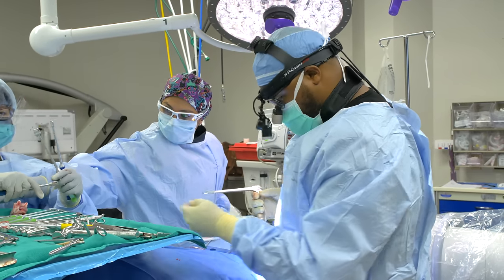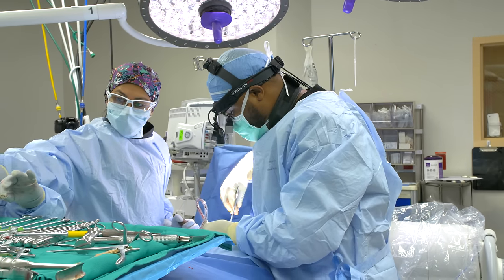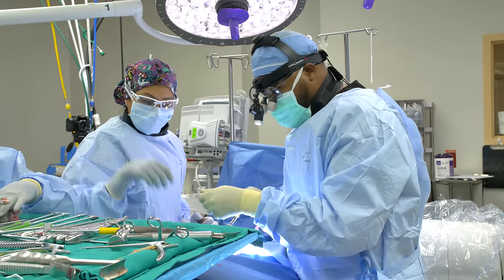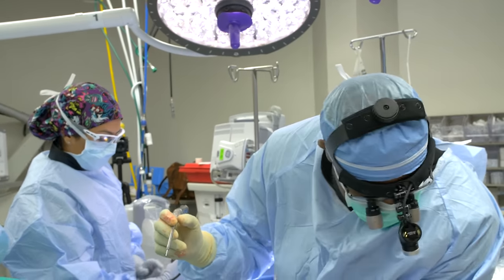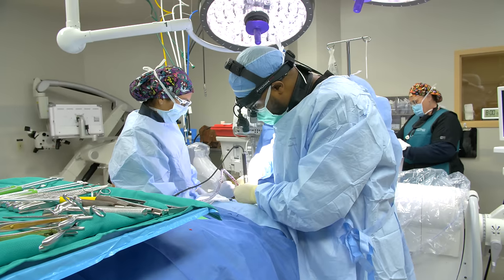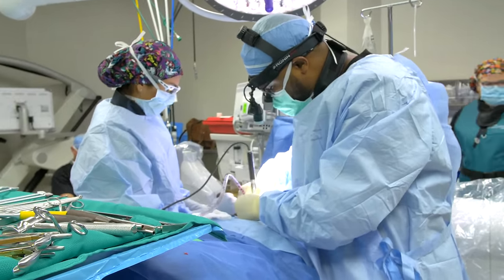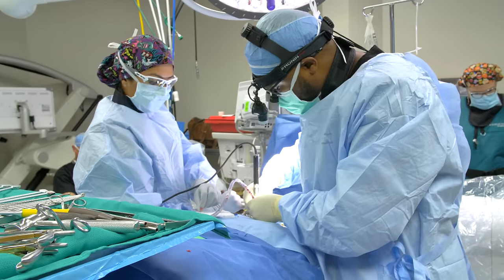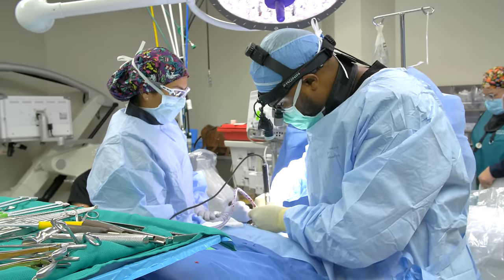All this bone we're removing from the bone spurs — also called osteophytes — we're going to use as graft, called autograft, to help with our fusion. We'll mix it with some synthetic bone graft. This is a high-speed drill; I'm using a foot pedal. Basically, doing some carpentry to the bone — removing all the bone spurs, forming a nice rectangle so that when we put our cage in, it goes in nicely and looks really good on x-ray.